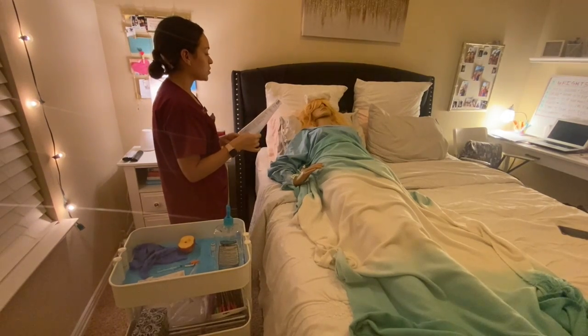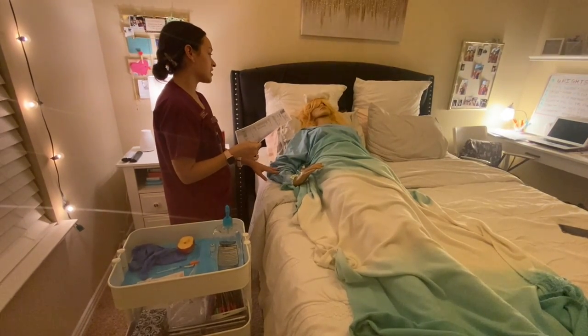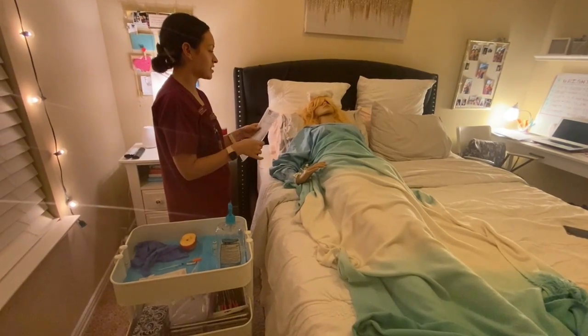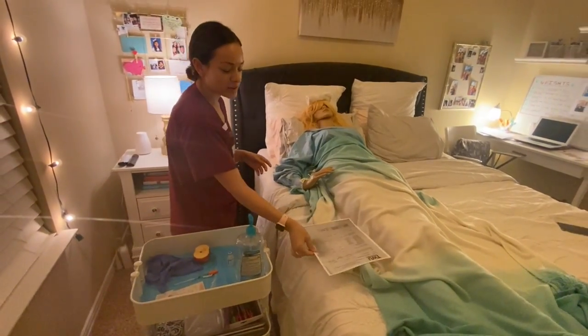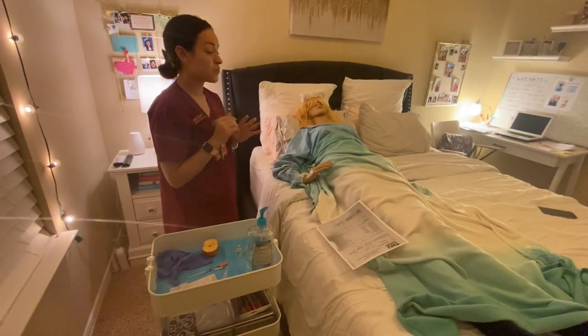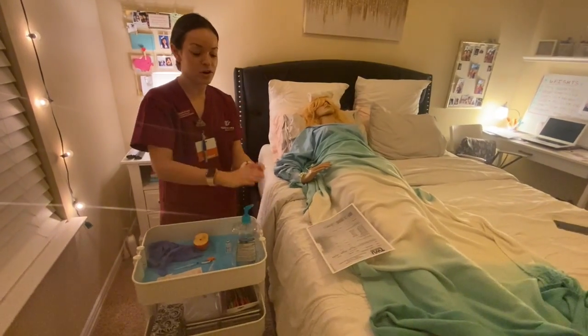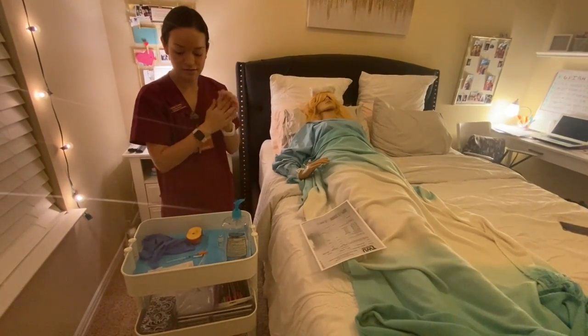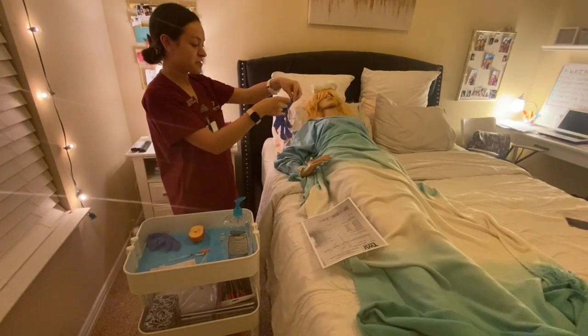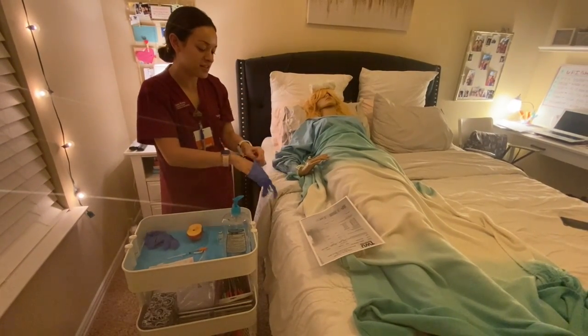And Mrs. Winthrop, you do have the right to reject this medication. Do you reject today? No? Okay, continue. Okay. So now I'm just going to place the order right here. And I'm now going to perform hand hygiene again and don a clean pair of gloves. Are you doing okay, Mrs. Winthrop? You're used to this? Okay.